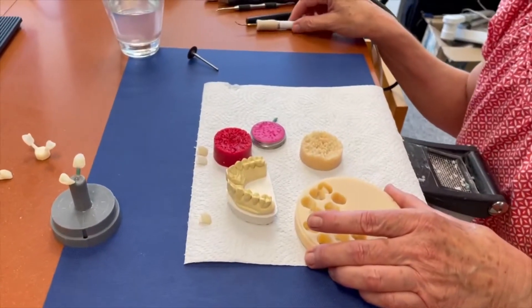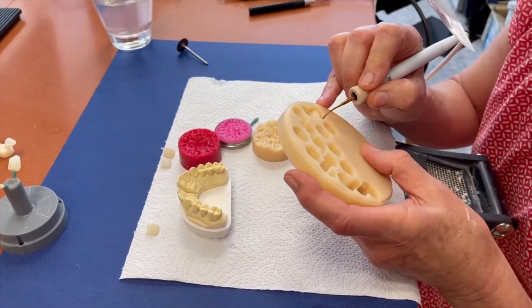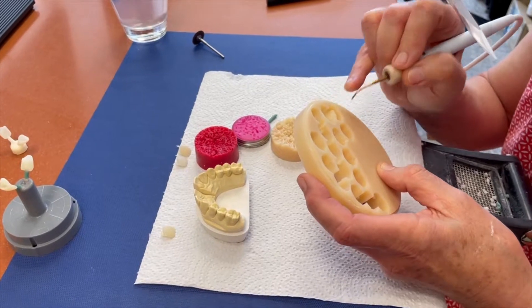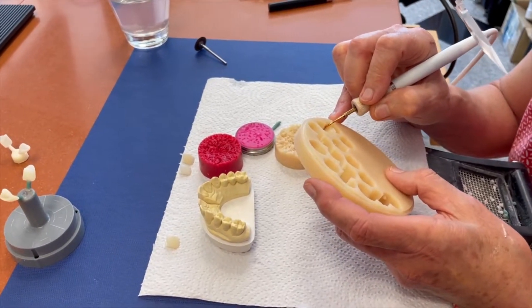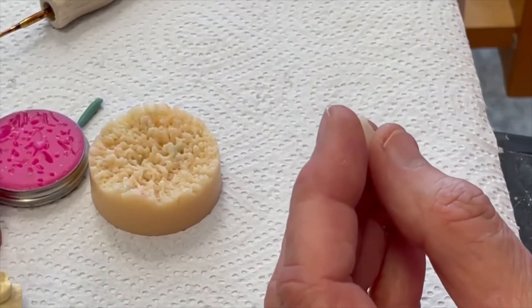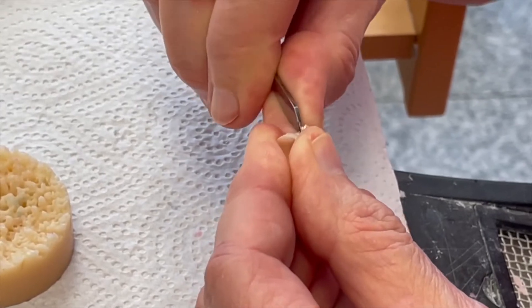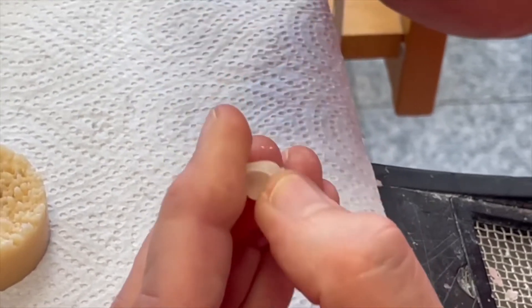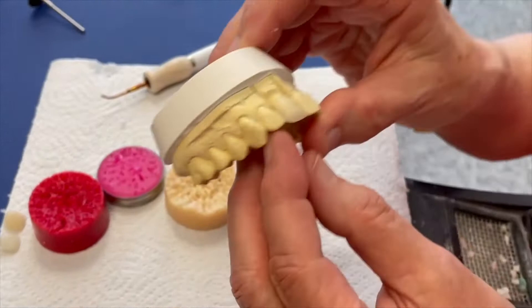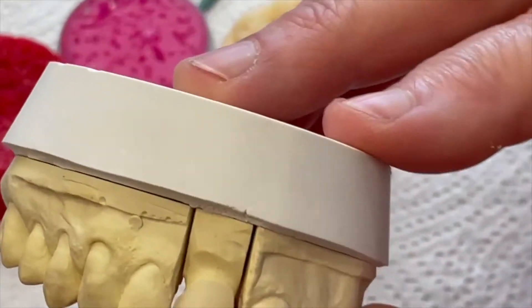Hello, good morning. Once again back in our laboratory — Andrea and Thomas, good morning. We were talking yesterday about the monolithic crown. Today we are talking about the cutback technique for the lithium ceramic. We milled in our milling machine the crown, as you can see here. This is in wax. We have to make the form a little bit more comfortable and we set it on the model. As you can see today, this is not the full crown, not monolithic — this is a cutback.